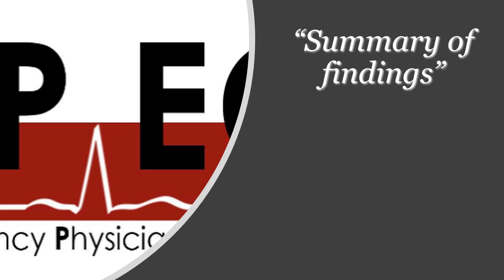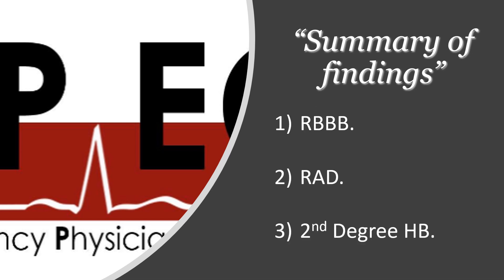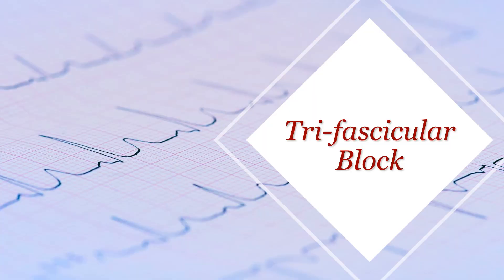In summary so far, the findings in our ECG are: right bundle branch block, right axis deviation, and a second degree heart block. If you combine the three together, that gives you the diagnosis — which is trifascicular block.